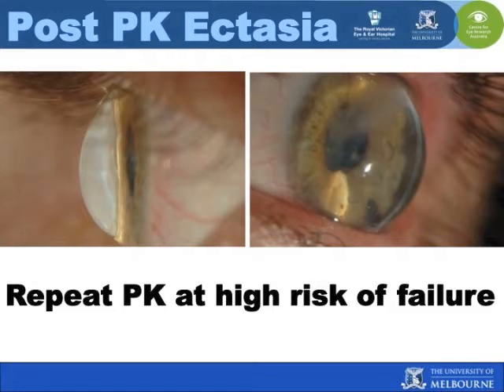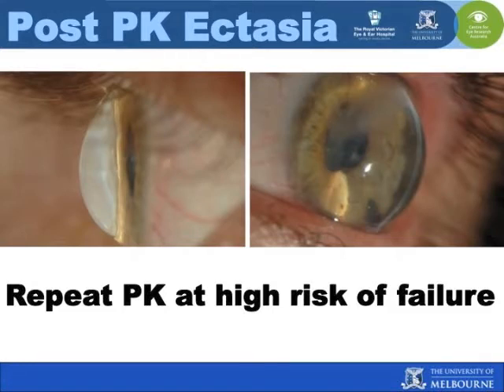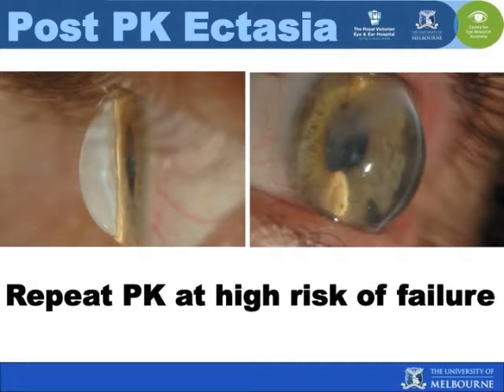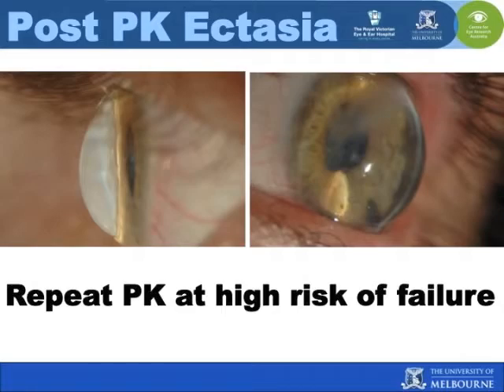A repeat conventional penetrating keratoplasty involves the use of a larger graft and its inherent complications, such as glaucoma and the increased risk of endothelial rejection.